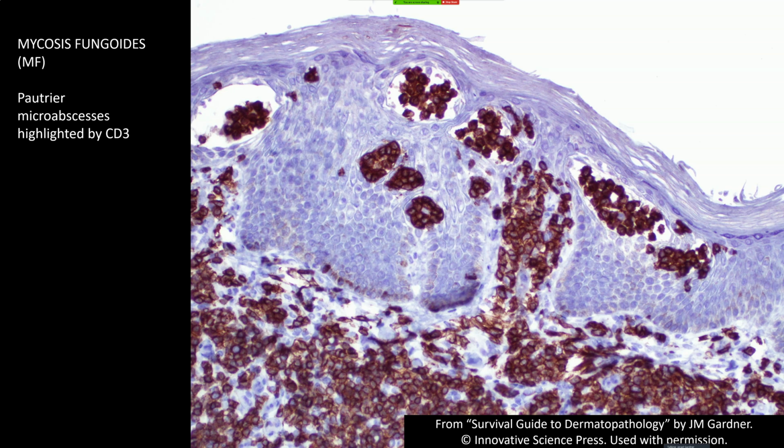If I've got a population of cells that's highlighting with neither 4 or 8, that's abnormal, right? If they're T cells, they should have either 4 or 8. You shouldn't be double positive, they shouldn't be double negative, and if they're all 4 or all 8, that's abnormal too. Okay, so the interpretation of those stains is quite challenging, as we'll talk about in a minute, but that's the general basic principle to start out with thinking about. And then again, the nuances are way over my head.